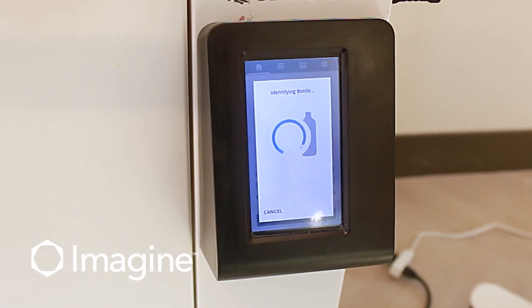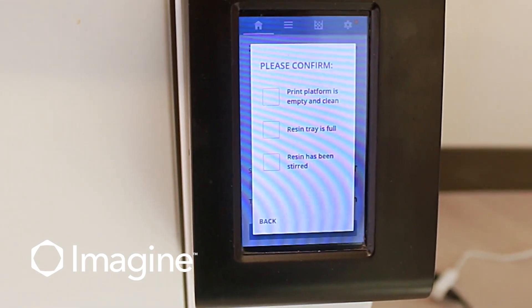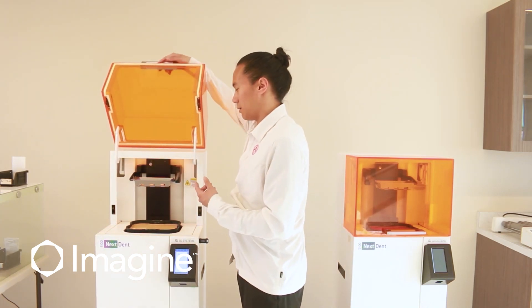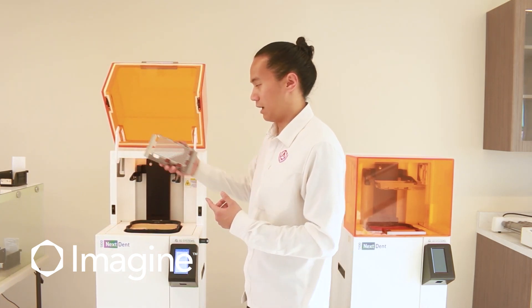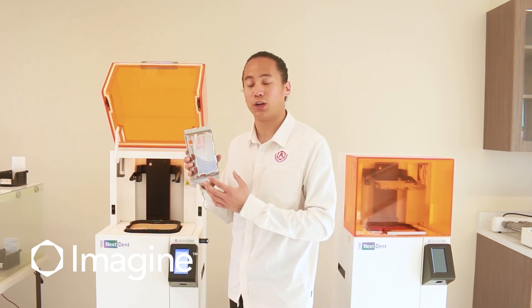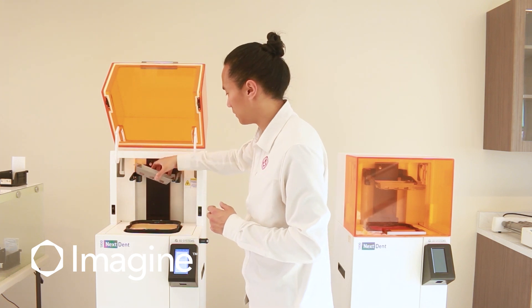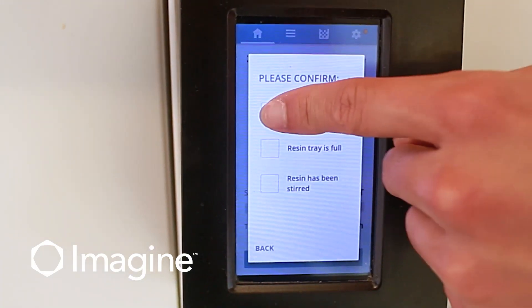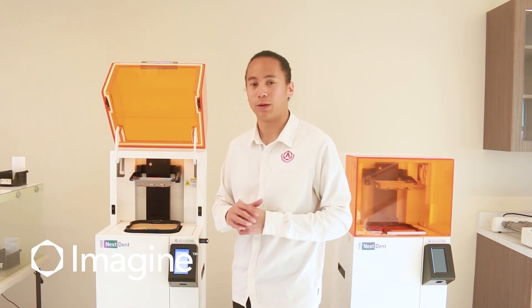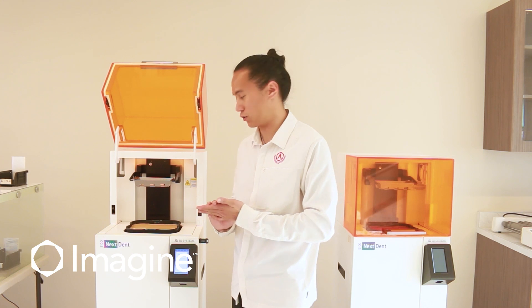After we scan the bottle, it's going to ask us to confirm three things. The first is to make sure that the build platform is clean and empty. We want to make sure that the build platform does not have any cured material inside and everything is smooth to the touch. After we've confirmed that, we'll click the check mark. The second thing we have to check is to make sure that there's an appropriate amount of material inside the resin tray.